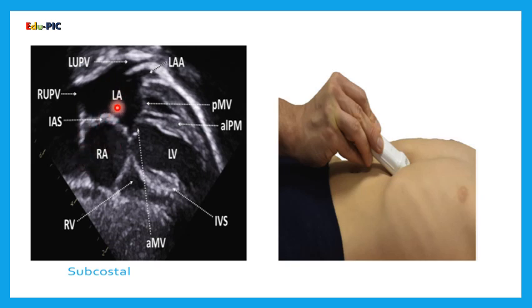To the left atrium, we have the left lower pulmonary vein, left upper pulmonary vein and right upper pulmonary vein, and this is the left atrial appendage. At the bottom here we can see the left ventricle with a mitral valve, posterior and anterior mitral leaflet, and here we have the right ventricle, and this is the interventricular septum.